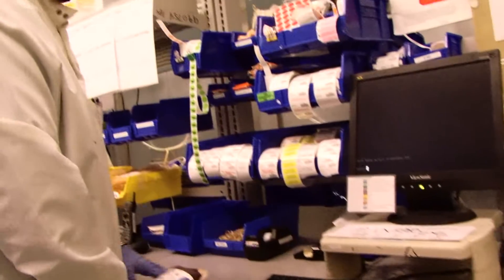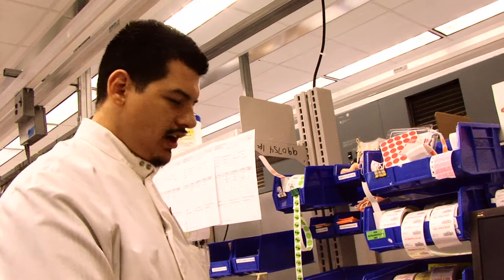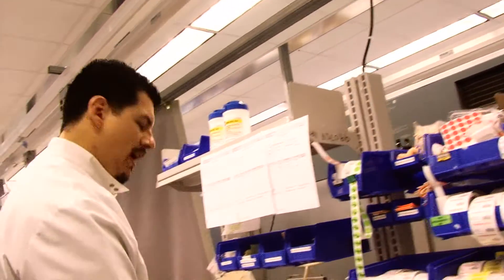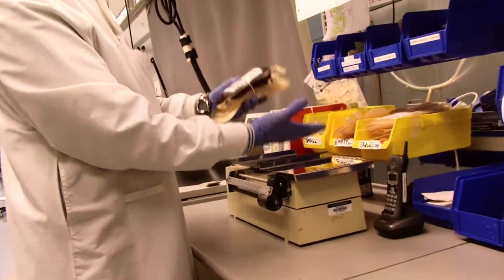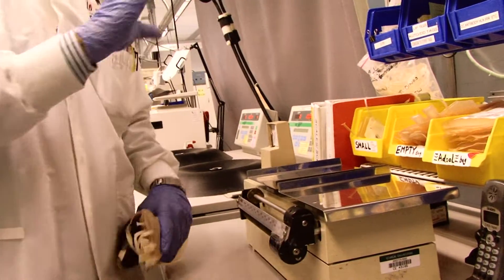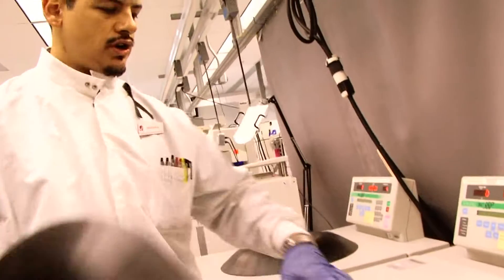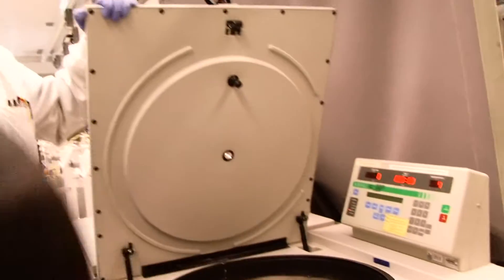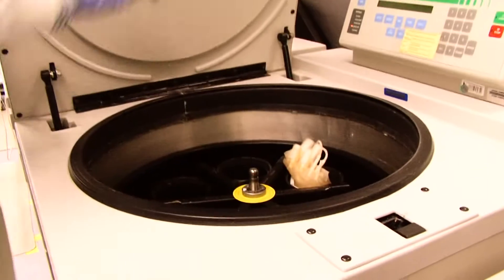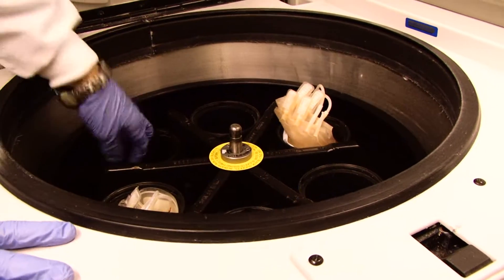We use all these labels right here, depending on what type of products we're going to make out of it, and we prepare it. We balance the units — we usually balance two at a time, making sure they're within certain parameters of each other. Then we come over here to the centrifuge where we place them.